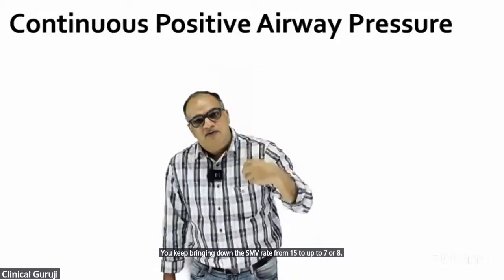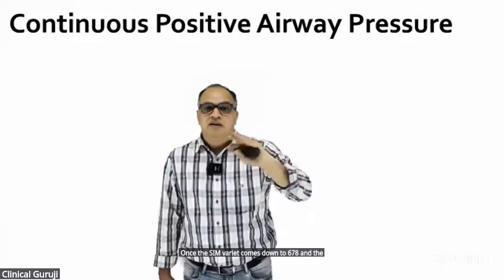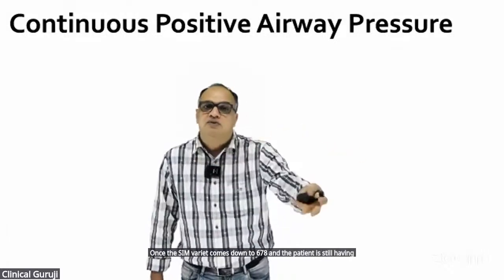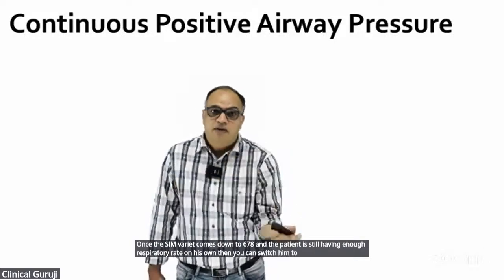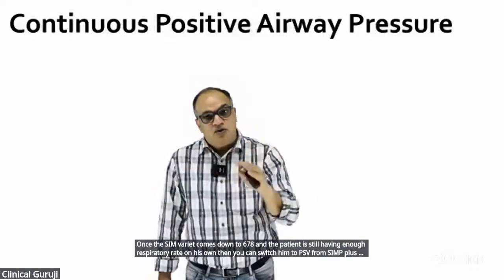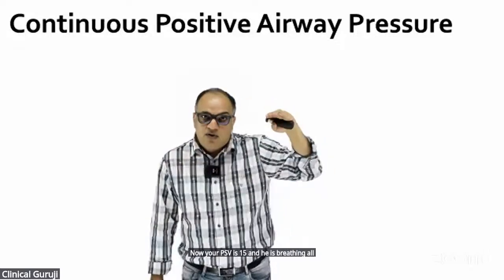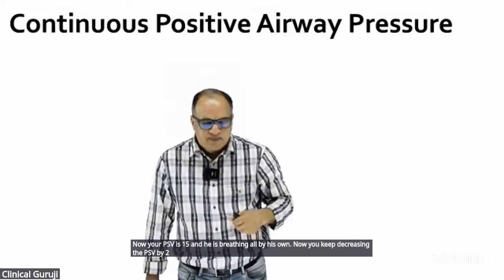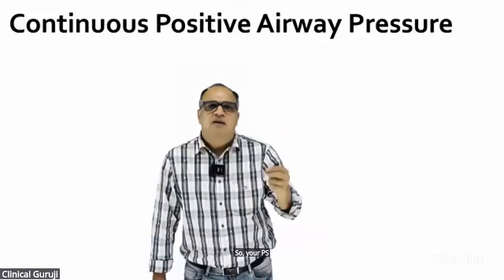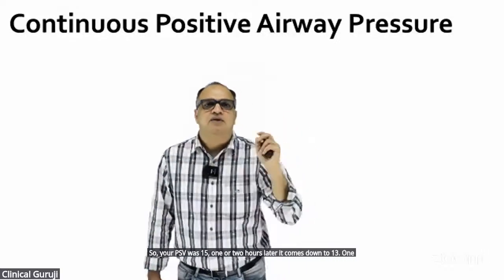Once the SIMV rate comes down to 6, 7, 8 and the patient is still having enough respiratory rate on his own, then you can switch him to PSV from SIMV plus PS. Now your PSV is 15 and he is breathing all by his own. Now you keep decreasing the PSV by 2 per hour, let's say. So your PSV was 15, 1 or 2 hours later it comes down to 13, 1 or 2 hours later it comes down to 12.